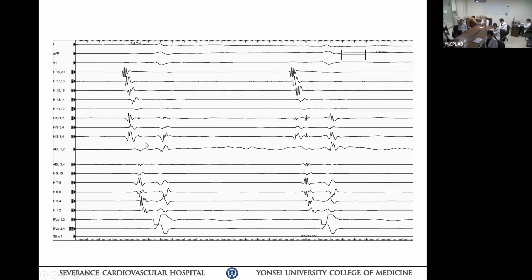And we are curious about this signal, which corresponds to the signal in the ablation catheter, but the distance is very long anatomically from here. Maybe this. Fluoroscopic here.